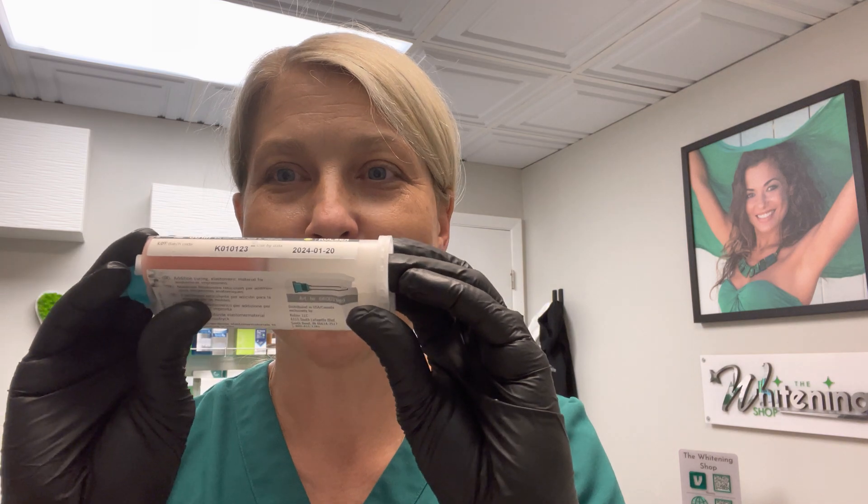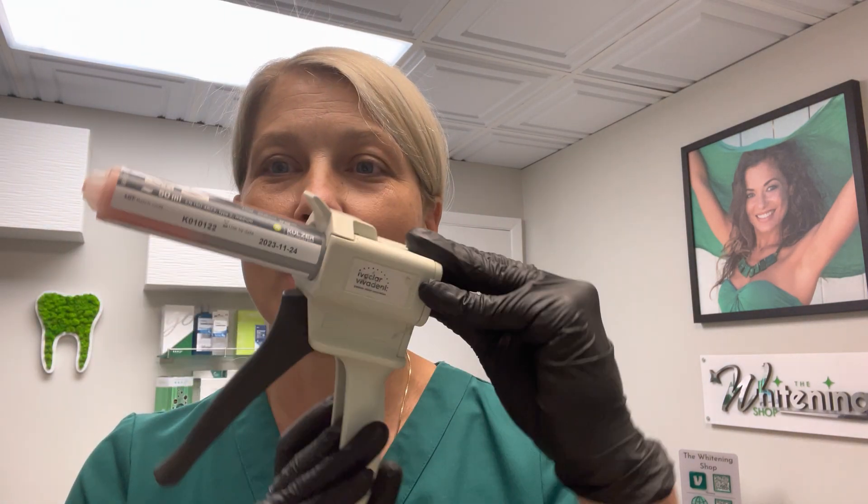A lot of us, when we pull out our drawers and we're looking at the cartridges, we see things just like this, where I've got a half-empty cartridge. Unfortunately, I have a lot of those in the drawer. And looking here, I've got another one. So what do we do?